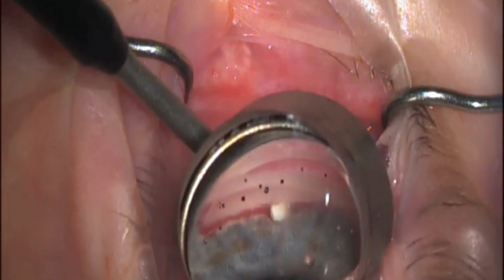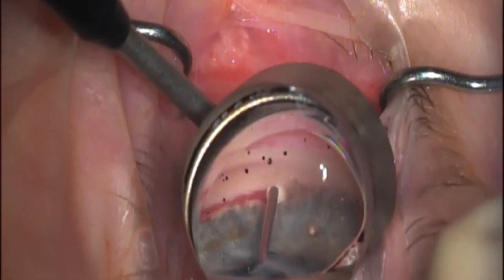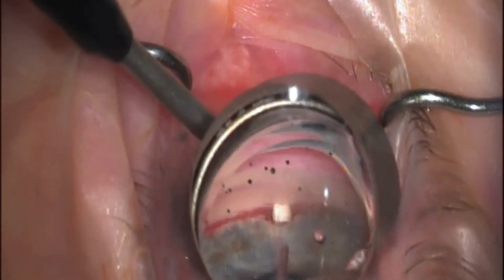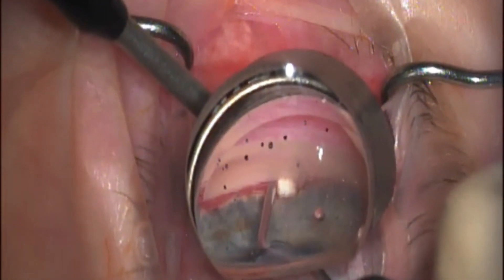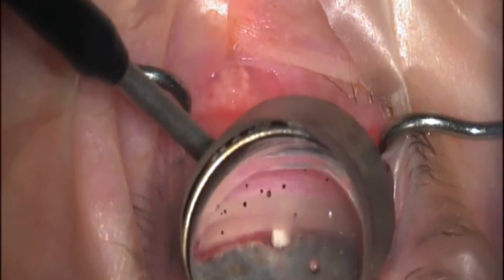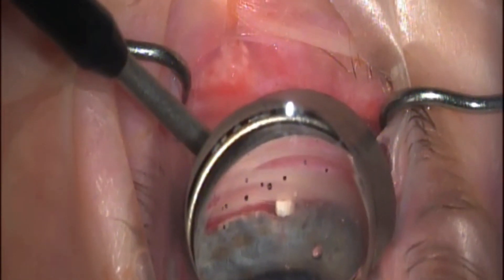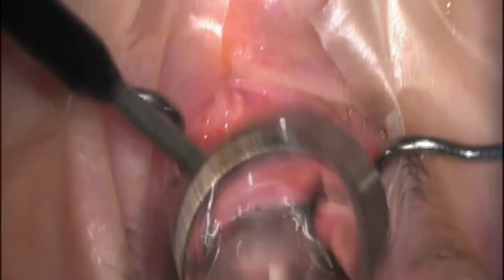Once it's in place, I can then bring my viscoelastic cannula back into the eye and I'm able to tap that stent a little bit more posteriorly if I need to. This is a nice demonstration of inserting just one of these scleral tissue pieces into that supraciliary space. Thank you for taking the time to watch this video.